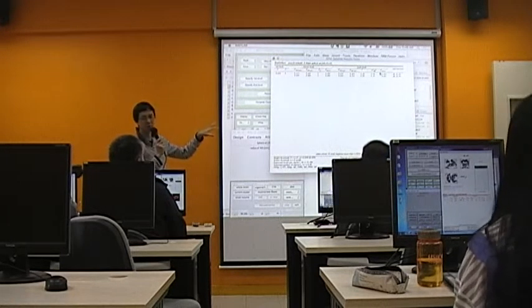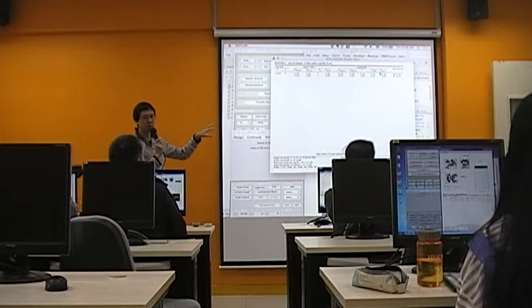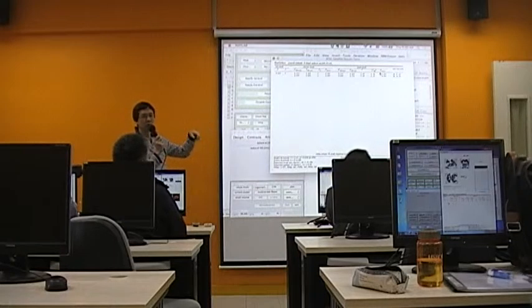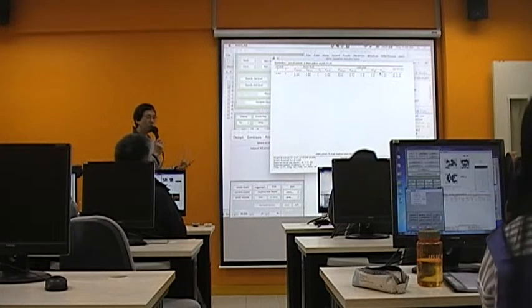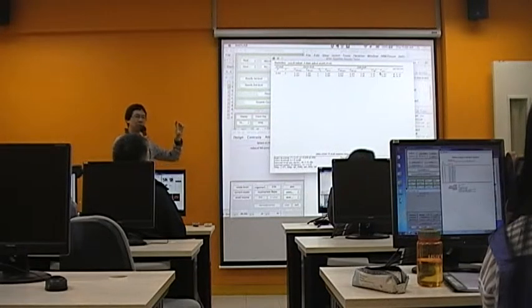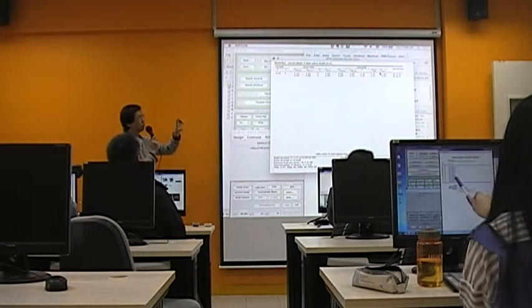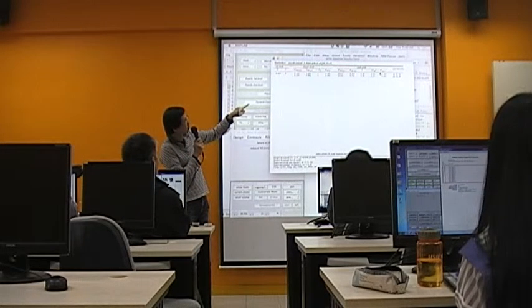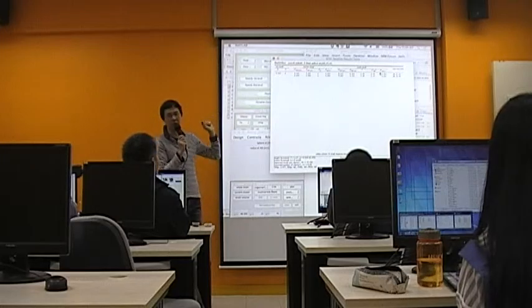We won't report it if we are doing small volume correction; we will ignore it. The t-value would be useful because we would still want to let people know the size of the effect. So the t-value, definitely you would report it, and then you would report the FWE corrected p-values.